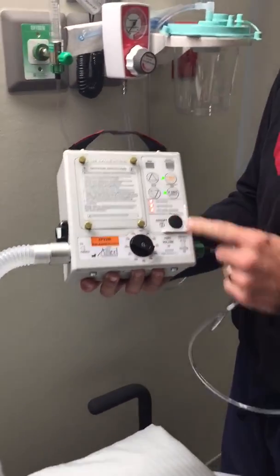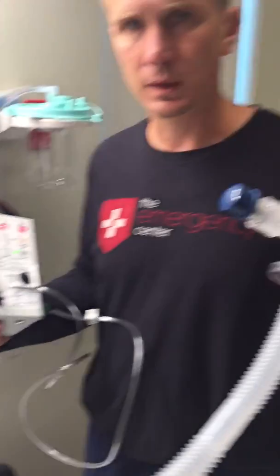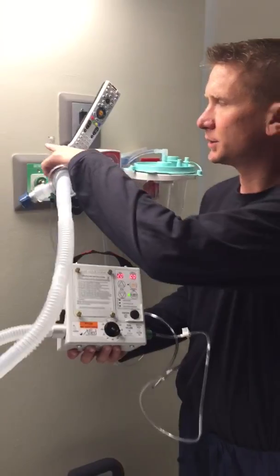Then on the vent we're just going to turn it on. You have your settings right here and now that it's on it's already working. As long as this oxygen is above 15 and maxed out, it should work just fine.